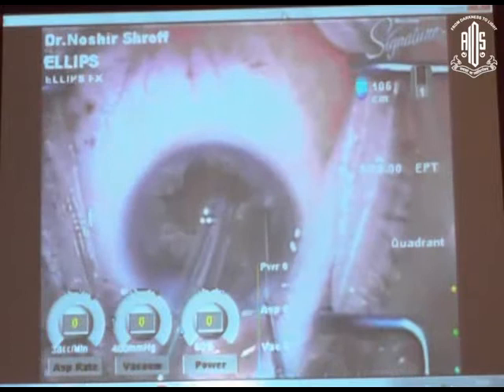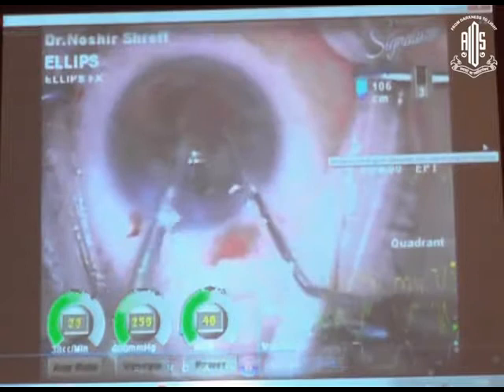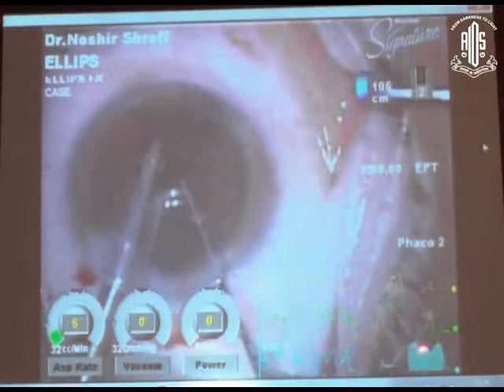The other thing I want to show you is the CASE vacuum, which is beginning. You can see at the bottom, there will be some serrations here which will come. This is how the vacuum is building up. And you see these serrations, this is the CASE vacuum. The vacuum falls a little bit, doesn't go down to the bottom. It falls a little, then goes up. Falls a little bit. So this prevents the chamber collapse.